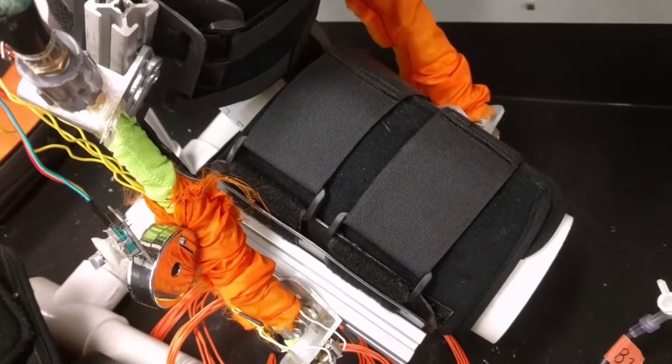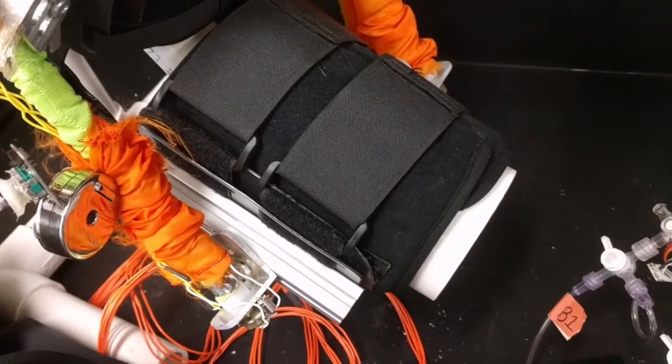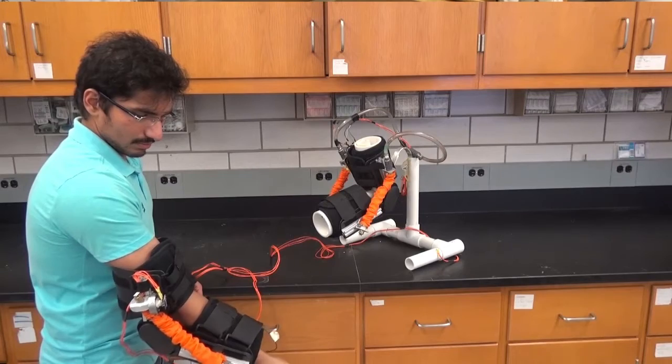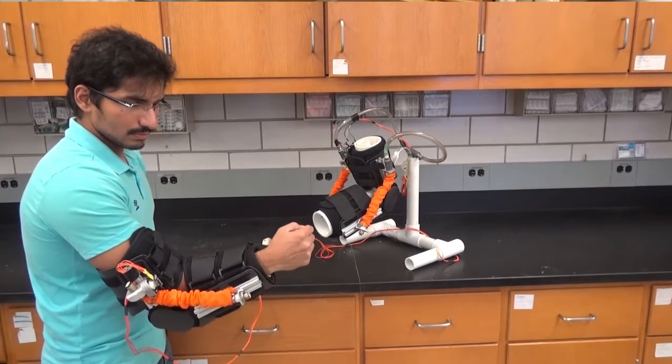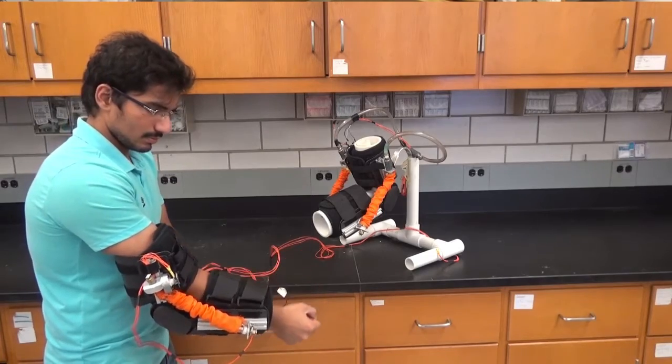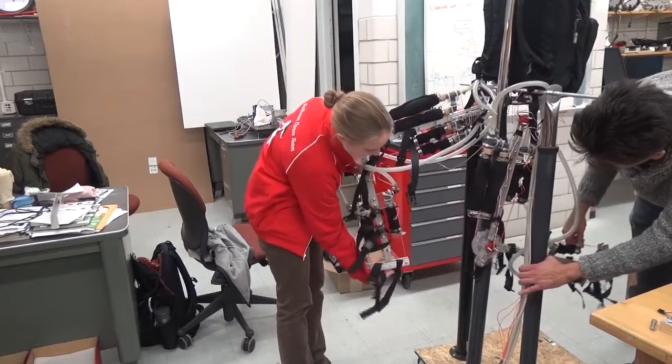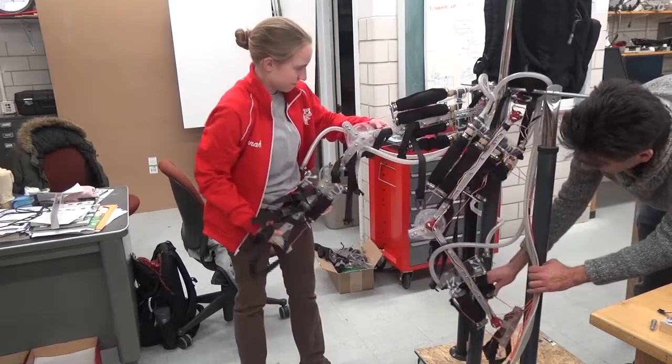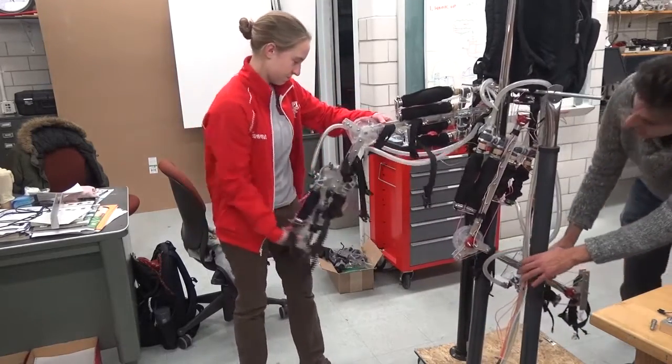Exomusculature is a similar concept as exoskeleton, except instead of rigid external structure, it consists primarily of soft actuators. Here are examples of elbow and leg exomusculatures actuated by hydromuscles. They can be used for rehabilitation or as everyday assistive devices. They can be used in pairs to allow robot teleoperation or human-human interaction, for example, between patient and therapist.